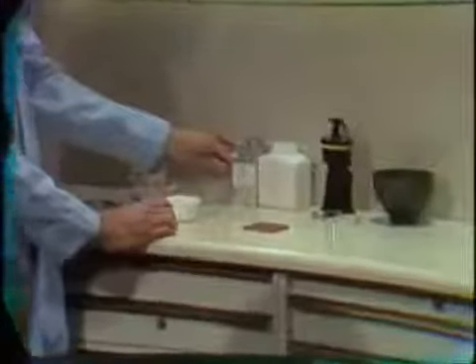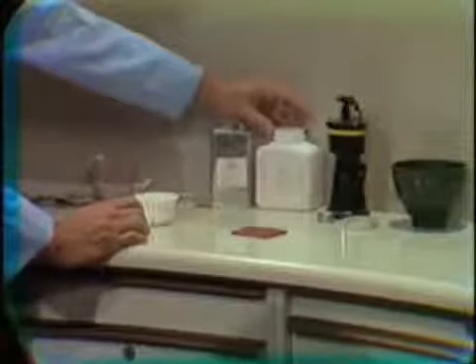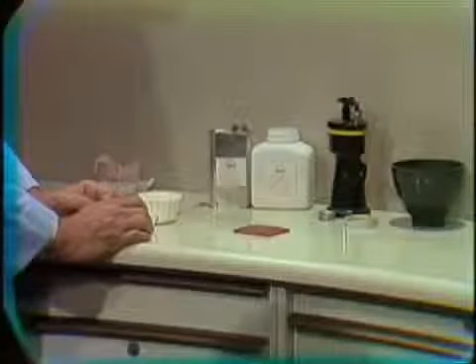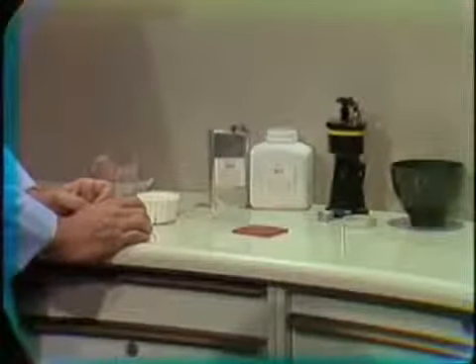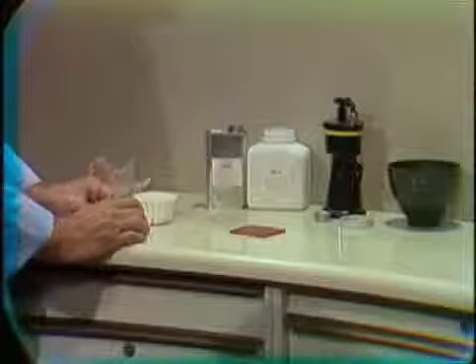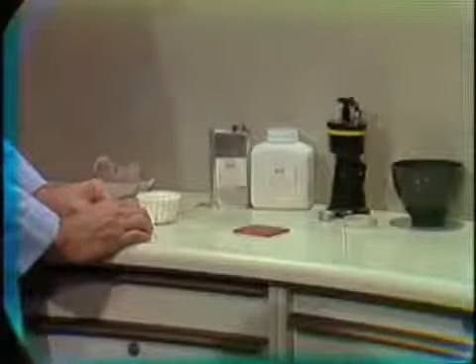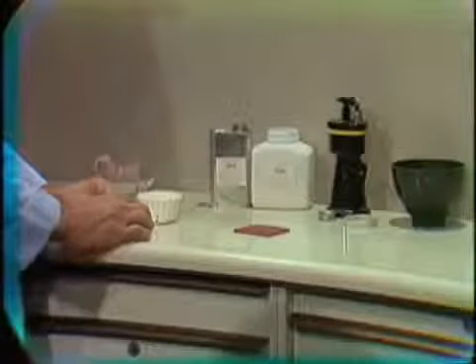The acrylic that we're going to use for this procedure is called TMJ acrylic. Now, other acrylics will work, such as a Formatray, tray material, or perm acrylic. But the TMJ acrylic has the advantage of having a lot of filler material in it, of diatomaceous earth, and it becomes a very dead acrylic without rebound. In other words, if the patient closes into it, the acrylic will stay without rebounding.